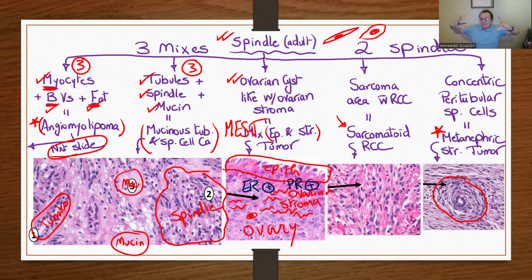It's a stromal tumor, spindle tumors, but the spindle tumors are making circles or a circular collar, like the collar of the shirt. It makes a circular collar around a tubule, which is a normal tubule. It doesn't look very cancerous, but they are saying tubule with peritubular concentric spindle cells. Kind of looks like the onion skinning of the bile duct that we will see in the sclerosing cholangitis. It looks kind of the same.